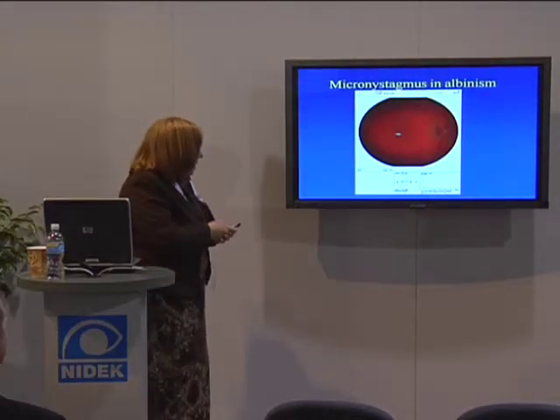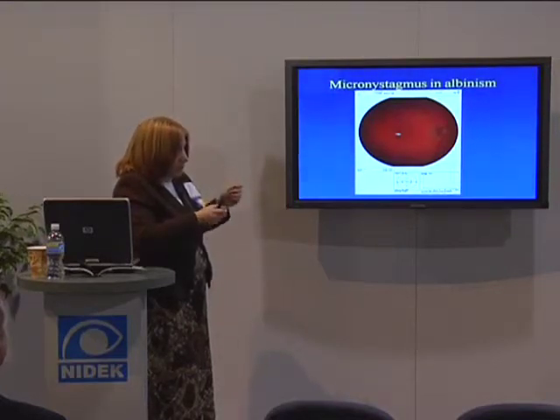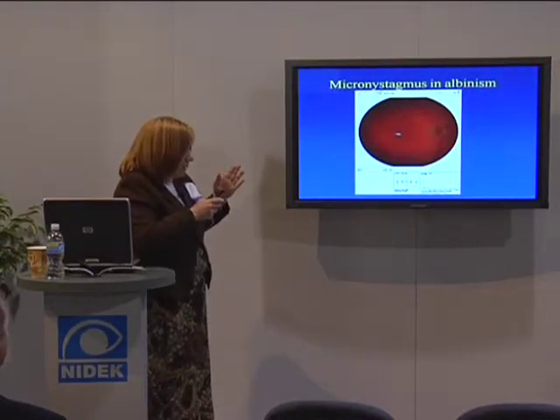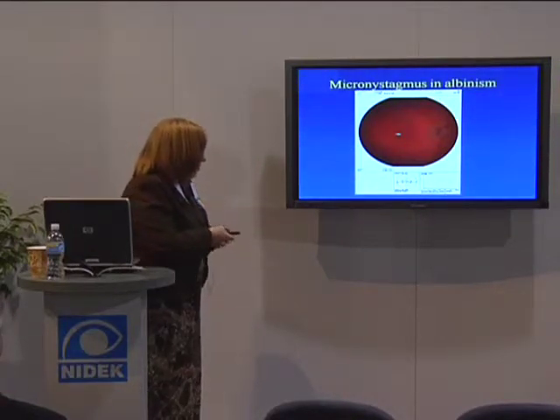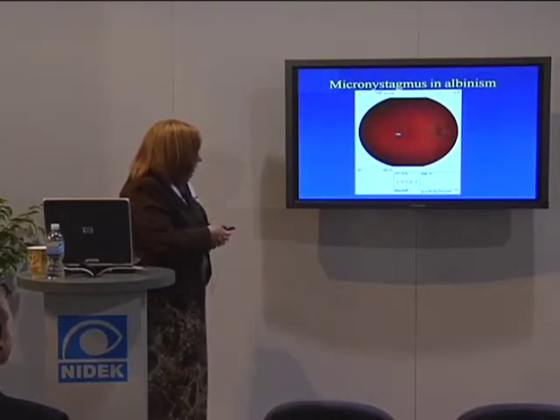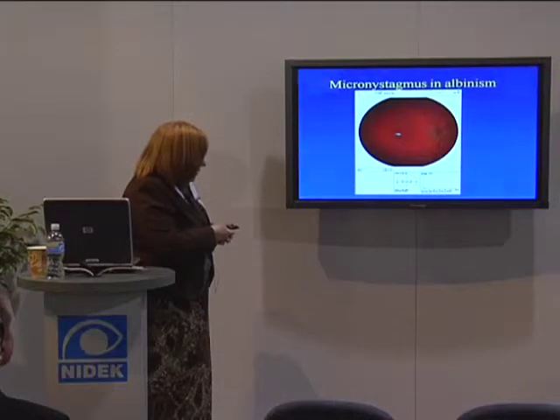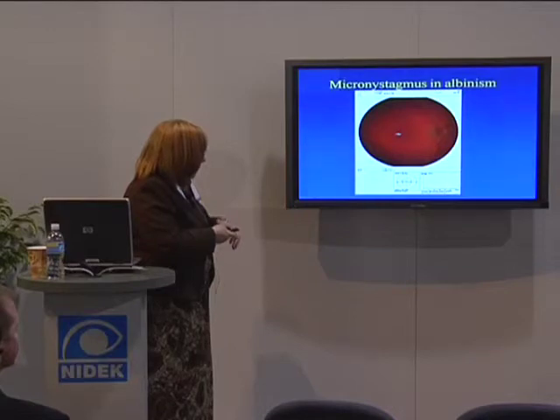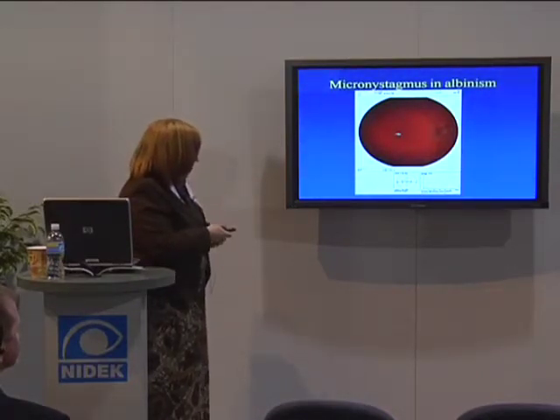Another feature is the fixation module, and basically you're not doing perimetry there. You set the person up and just have them look at the cross for however long you want. Usually I do 15 or 20 seconds. And you can get this for perimetry as well. You get a little fixation map of what percentage of all the fixation points are within a 2-degree circle centered on the fixation, and a 4-degree circle. So it ranks it sort of as stable, relatively unstable, or unstable.